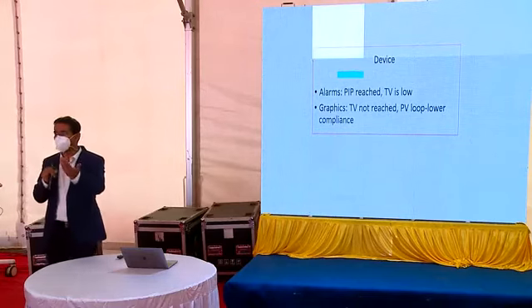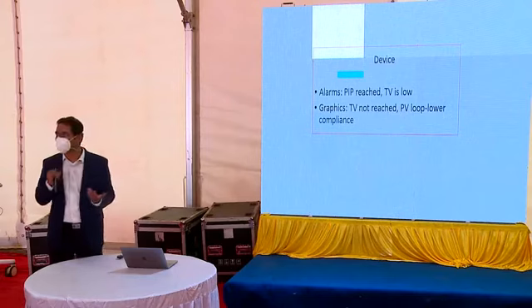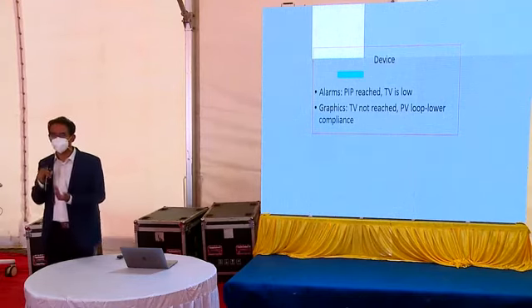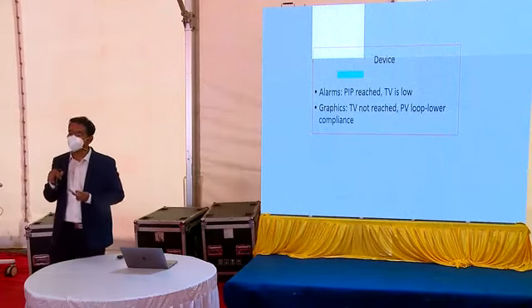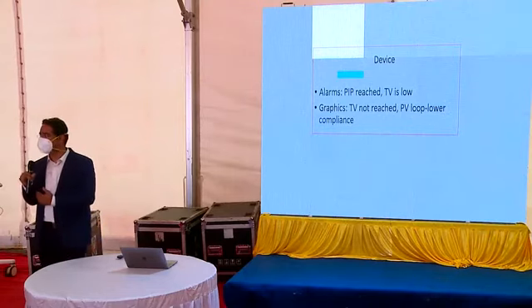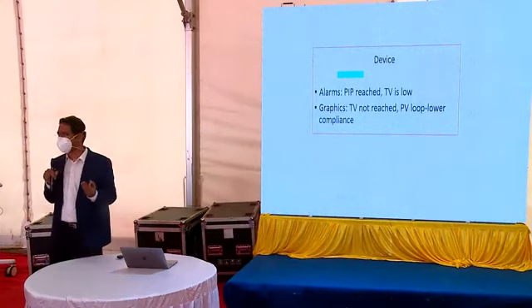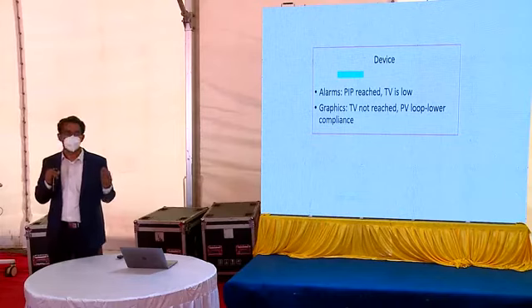Yes, excellent. So the lungs are very stiff. If the lungs are compliant, then you generate a pressure, they always get distended. They are not compliant here. So why should the lungs on a term baby be not compliant? Again, pneumothorax or single lung ventilation, where your tube is completely in the right lung. So these two are possibilities. Very rarely, again, pulmonary hemorrhage, congenital pneumonias, all these things are a possibility, but the most common ones are these.